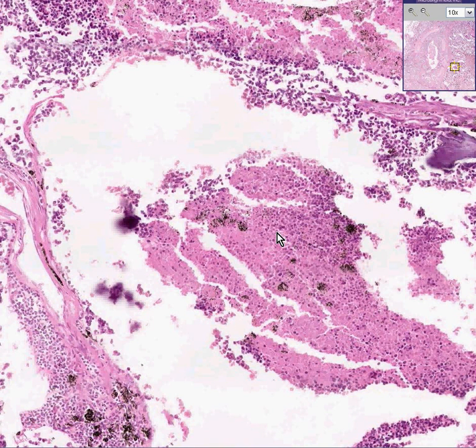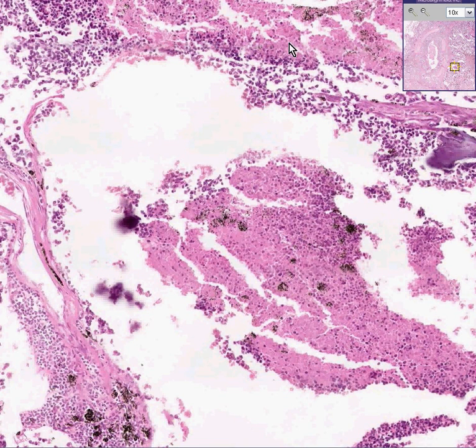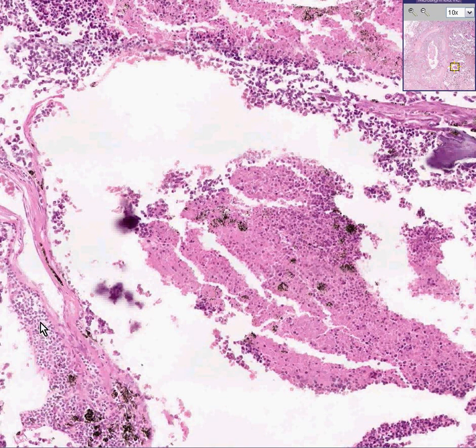Here the tumor cells are not necrotic, and here the tumor is necrotic again. Here's an area of calcification, and here are some tumor cells. They are small cells — they look like lymphocytes actually, but they're extensively necrotic. And this is a small cell carcinoma. These are neuroendocrine cells.